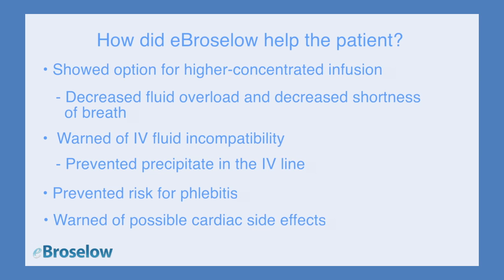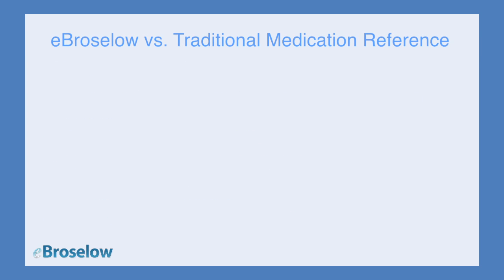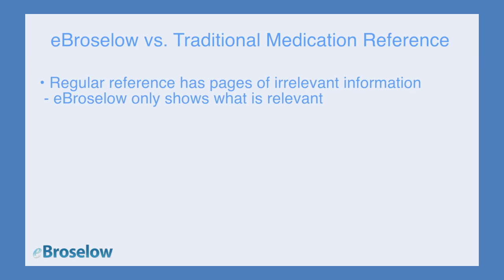Finally, eBroselow warned of the potential for cardiac side effects. She elected to place the patient on the cardiac monitor during the infusion. This increased patient safety. To compare eBroselow to a traditional medication reference, you must first remember that a regular reference groups everything by the drug. You have to read through paragraphs of irrelevant text to figure out the instructions for a given diagnosis.